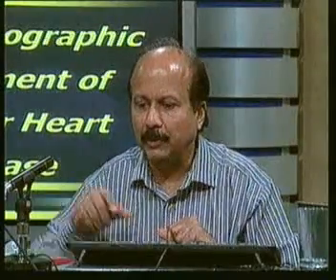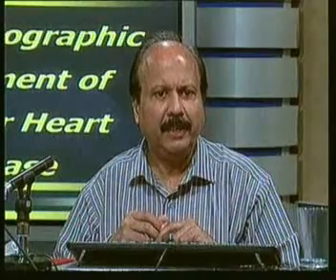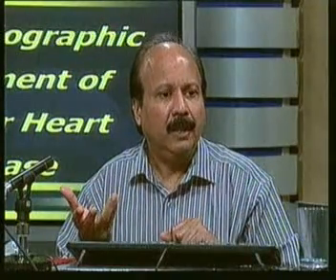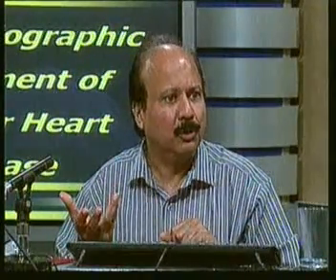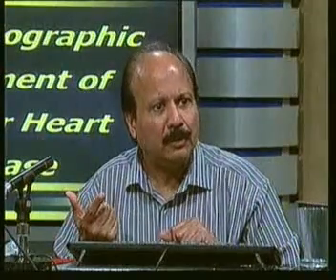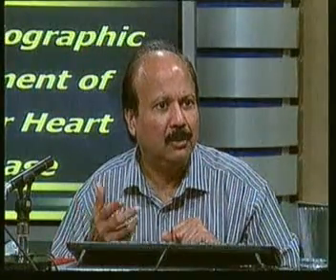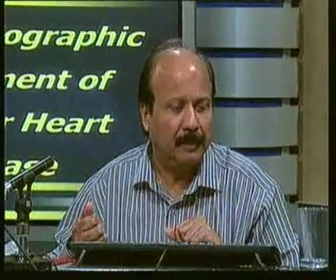See, one of the things which people say about echocardiography is that they say, oh no, it's too operator dependent. Well, if the operator is well trained, if the operator knows what he wants to show, then two good operators will come across the same valve area, whatever you may do. But this is one of the things which people who are not used to echocardiography always level against echocardiographers. Oh, this investigation is too operator dependent. Well, everything in life is operator dependent for that matter.